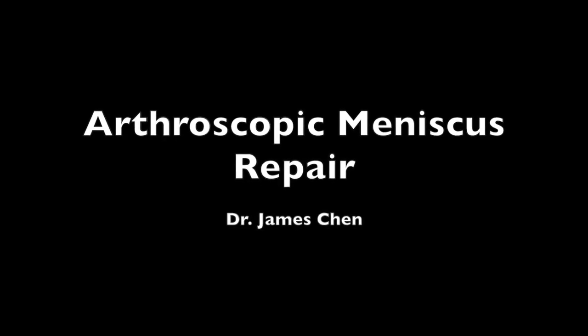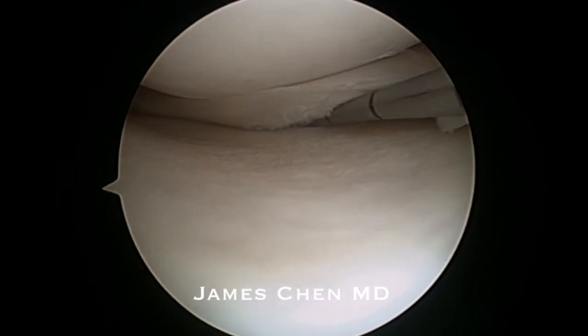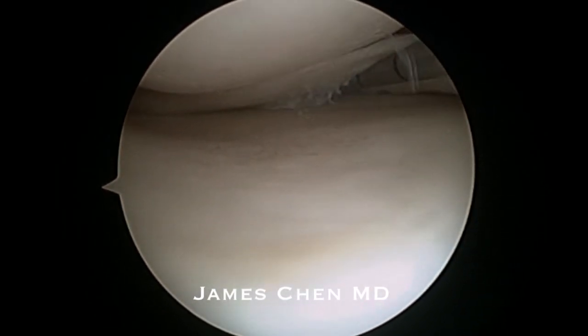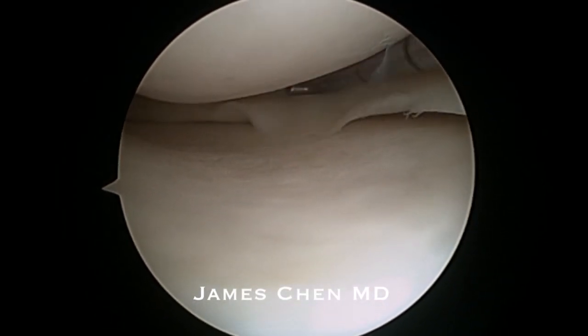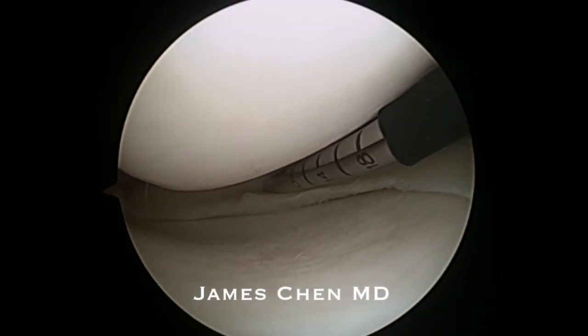This is a video of an arthroscopic meniscus repair with an all-inside device. Here I am probing the posterior horn of the medial meniscus and you can see the meniscal tissue subluxate forward, indicating that there is a cleavage type tear.